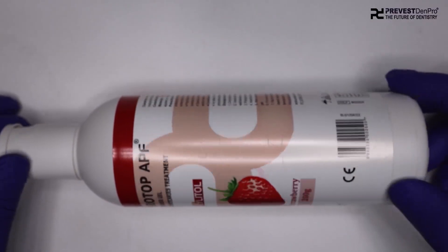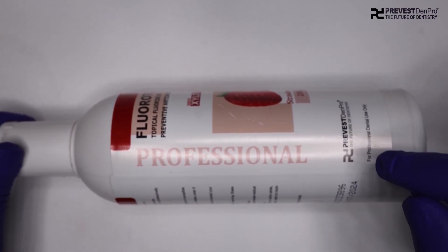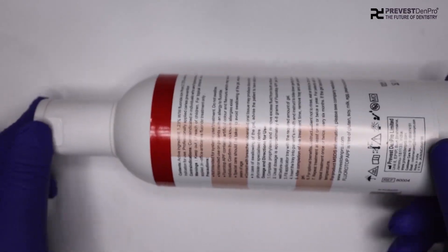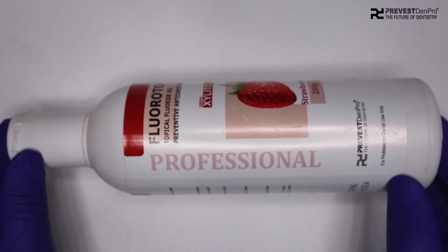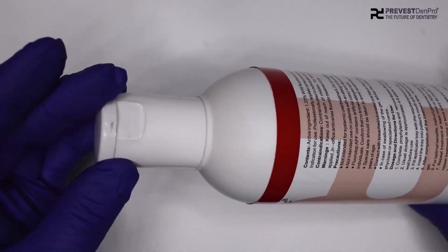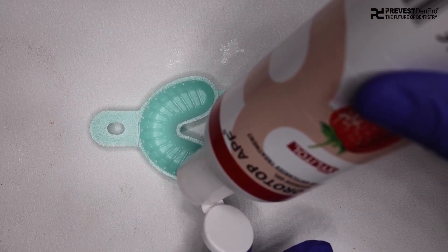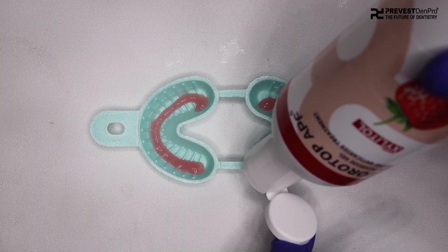Coming to the third step — that is loading Fluorotop APF onto the foam tray. This is a topical fluoride gel developed by Prevest Denpro, and it contains 1.23% acid phosphate fluoride. Before using, we need to shake the bottle. The usual dosage is approximately 4–8 grams of Fluorotop APF per dual arch foam tray, and we need to fill the applicator tray with the required amount of gel.